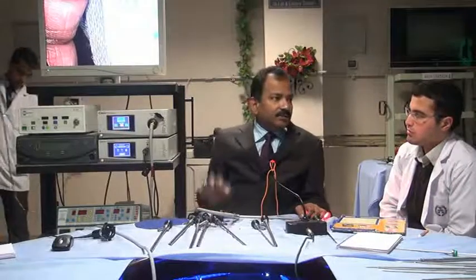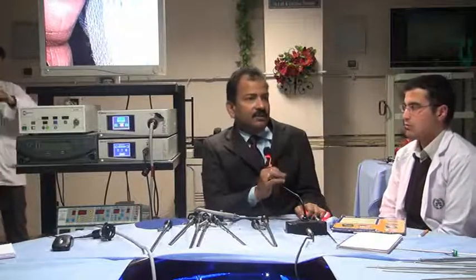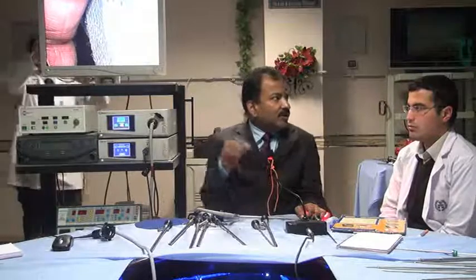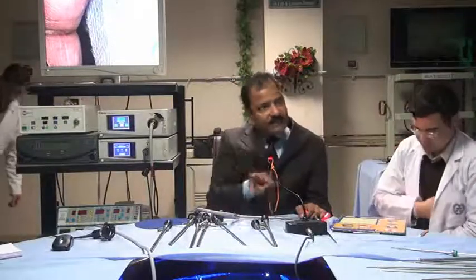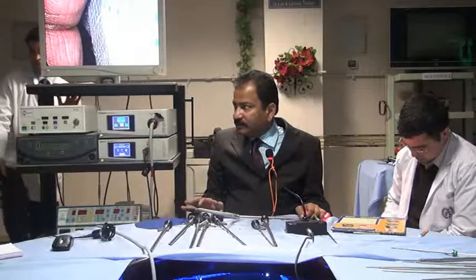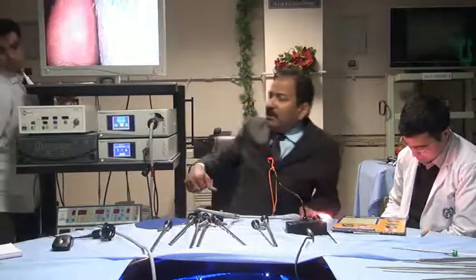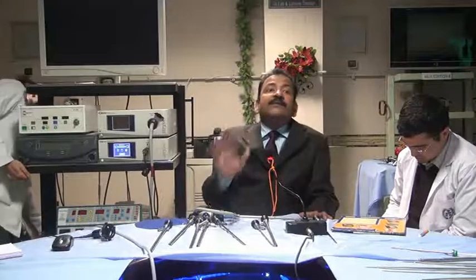But sometimes in thoracoscopy we need 45 degrees, so that you can see more angle. And in bariatric surgery also 45 degrees is useful, to see the angle of His or to see the complete retrogastric tunnel for gastric banding, or for bypass to put the stapler in the posterior omental bursa. Those are better with 45 degrees. No, you can make it because you are putting it at Palmer's point, and that's why on the side your telescope can go down also like that, isn't it? But 30 degree is better.